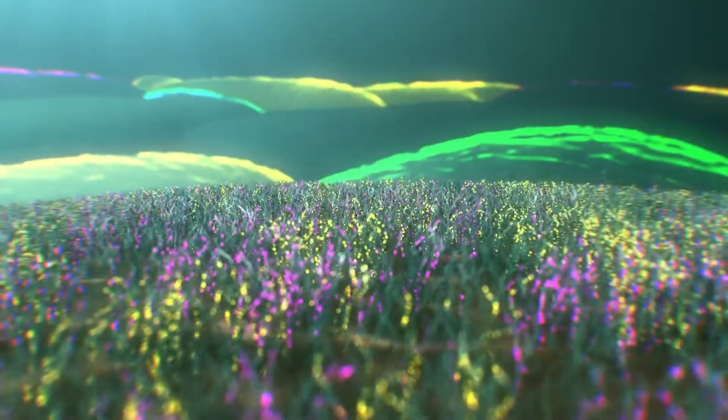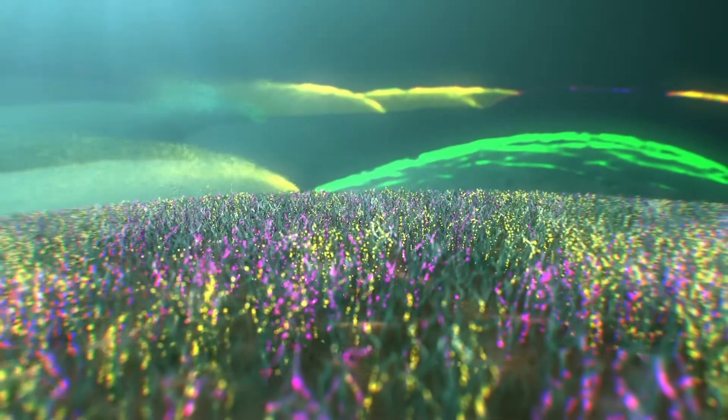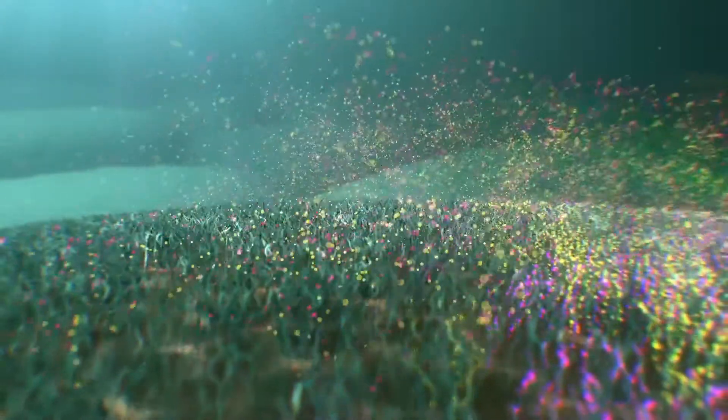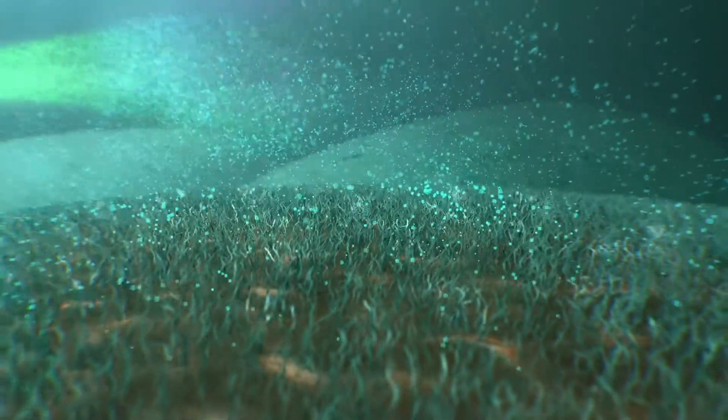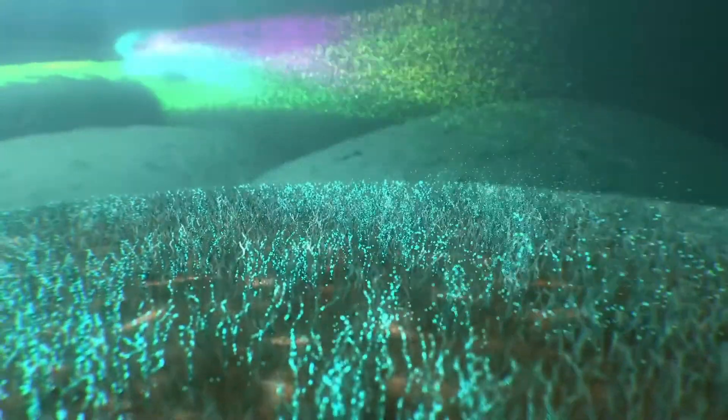After imaging, the probes are unlinked from the DNA barcodes through a process called DNA exchange, allowing multiple passes of non-interfering signals to be imaged and measured.